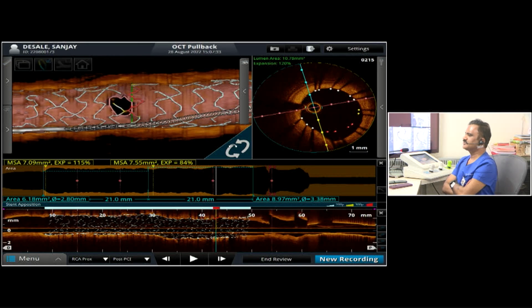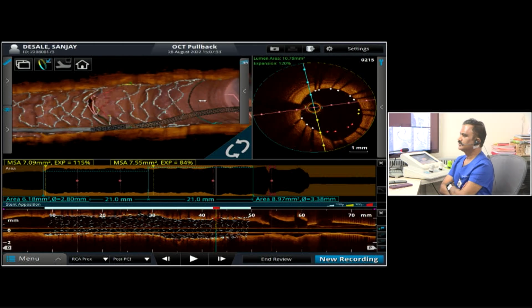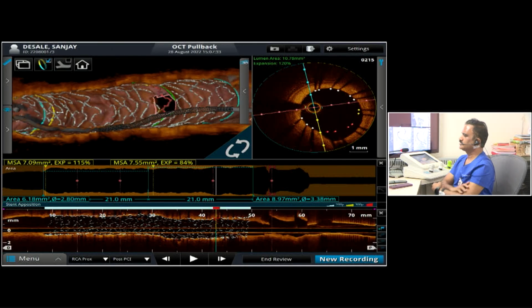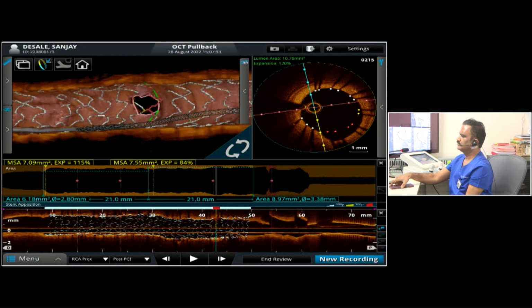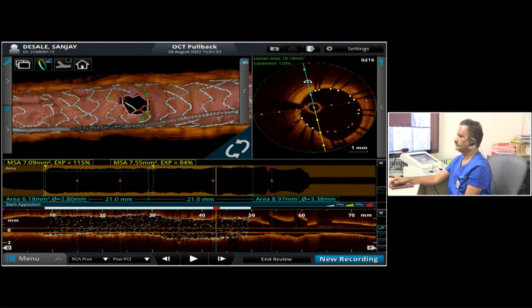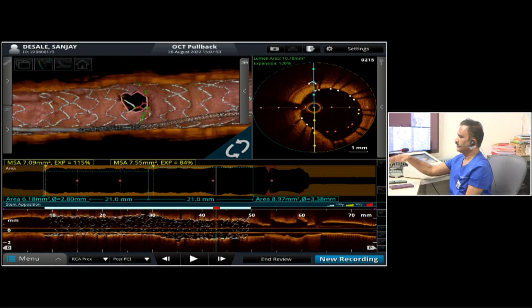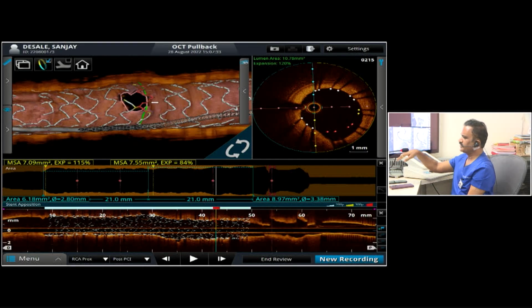There is a branch. That's why we are able to see that. Yeah, probably the rotation can appear also because of that. Rotate it 360 degrees, the OCT circumferential view. Not that. Go, more angulation. Otherwise it's probably just angulation because of the branch, it is showing towards the right side.